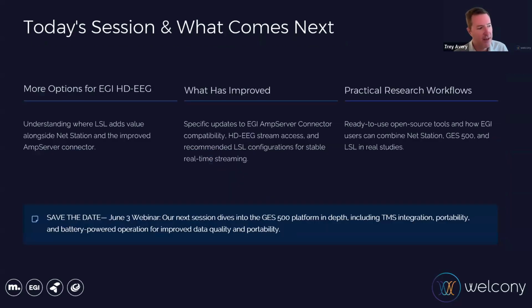And we should reiterate that we still use NetStation for a variety of approved research and clinical workflows for acquisition of EEG and visualizing high density EEG in particular, as not all tools are able to render high density EEG at the same level of ability or in multiple views. So we see these as two symbiotic options for being able to do high density EEG work.